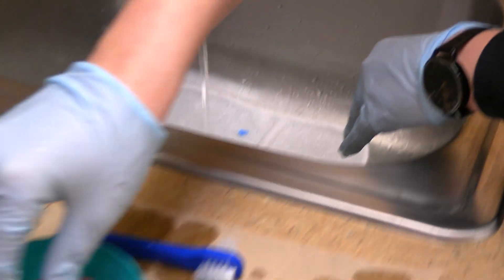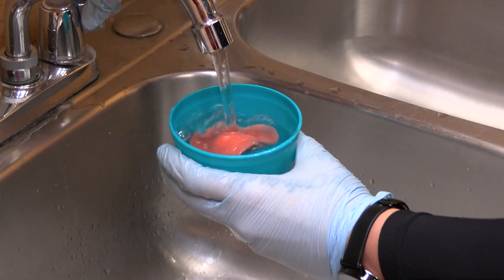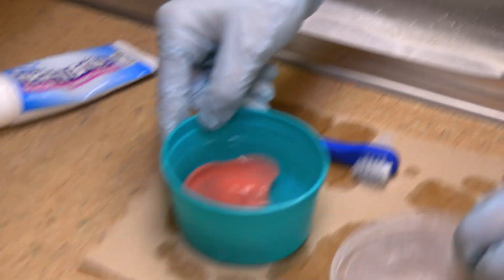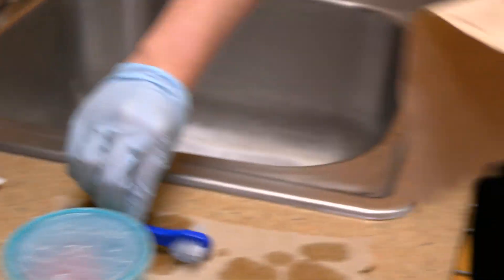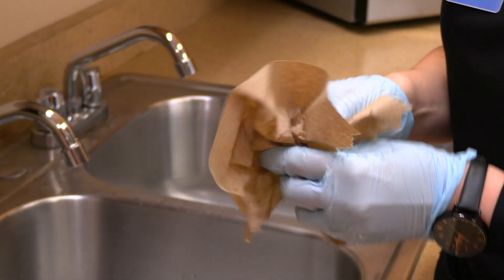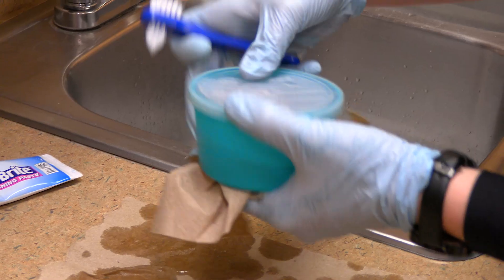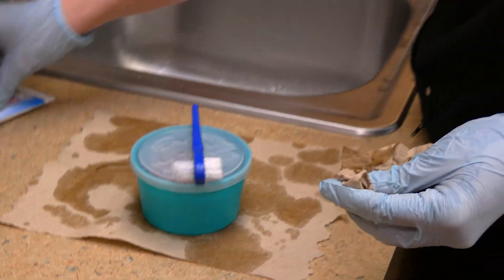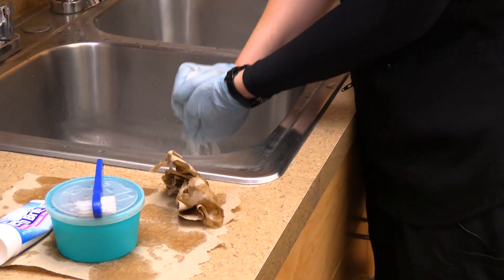Now that my dentures are rinsed, I'm going to put them back in the cup and fill them with cool water. I'm going to grab another cloth and dry my denture brush and my cup.